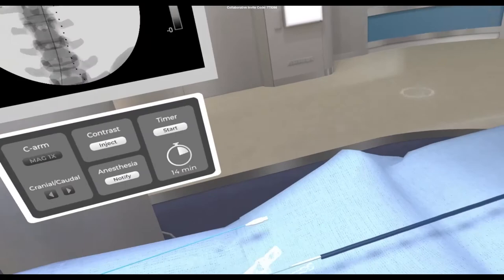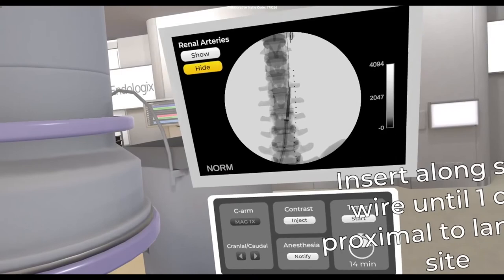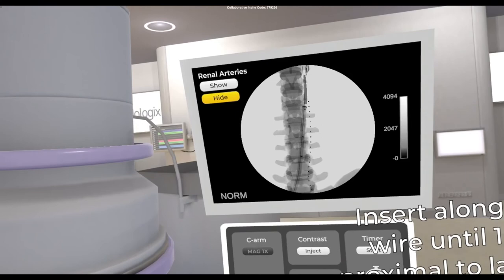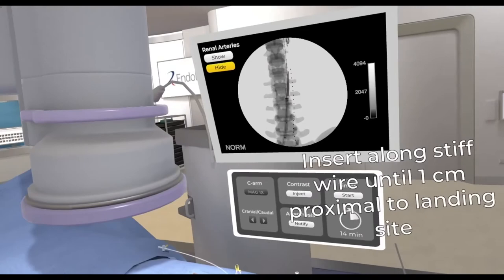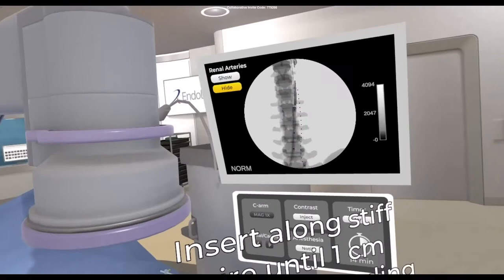That controller that Stuart was handling now looks like a hand. And now we're putting that up inside the patient. The x-ray is on, you can see this, and we're going ahead and actually deploy the device. So we see this as having huge applications in medical education. We also see this when we talk about the robotics we've just talked about as being one of the ways that we may be able to integrate some of that imaging into the robotic system.